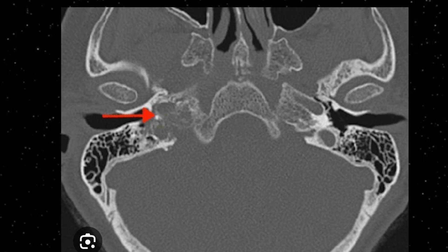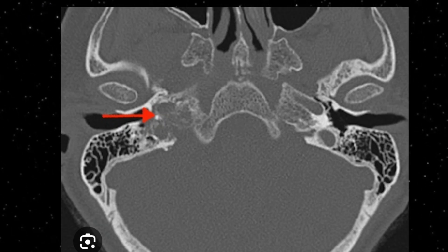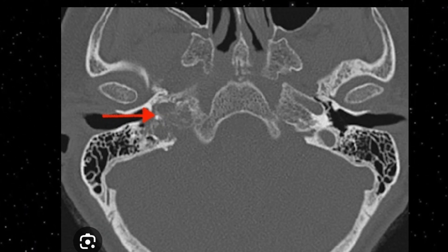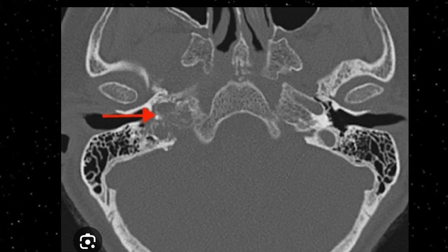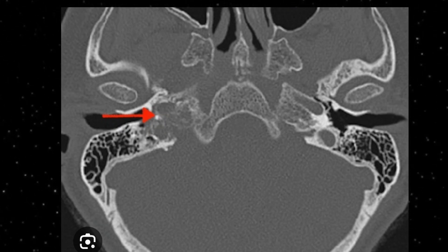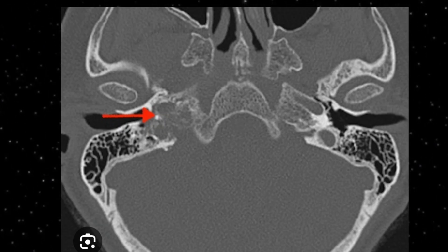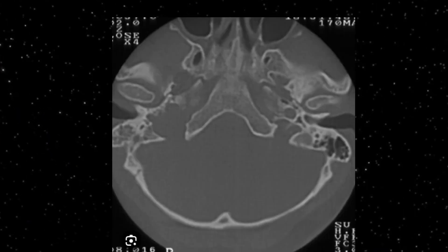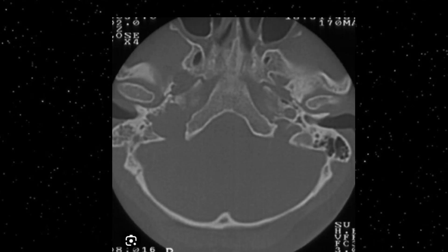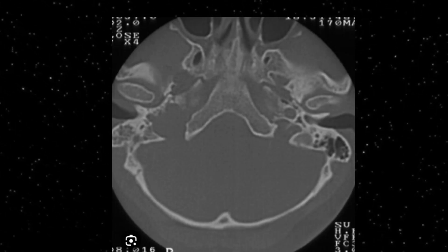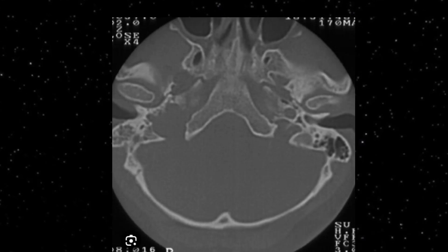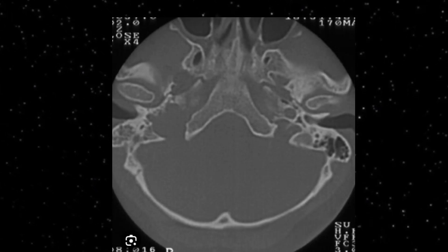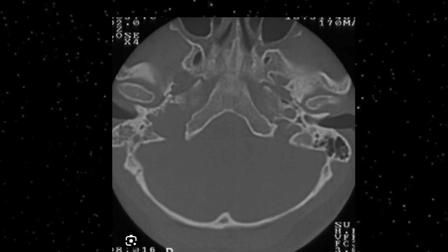On this non-contrast axial image, on the right side you can appreciate the dilated or enlarged jugular foramen, which shows soft tissue density — this is the glomus jugulare tumor. You may also be able to see the moth-eaten destruction of the bone. On another axial image, there is moth-eaten bone destruction with soft tissue mass and enlargement of the jugular foramen.